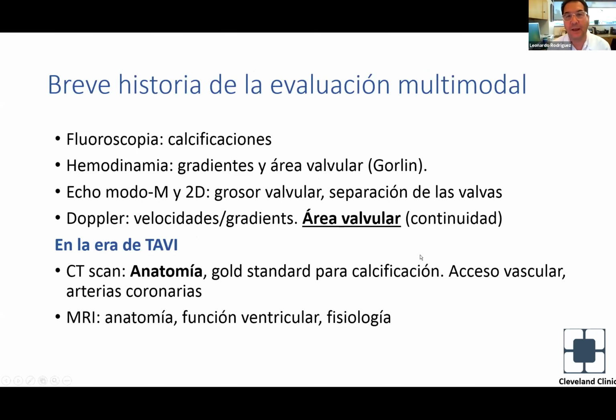Como decía el doctor Piñero, yo soy un poco mayor ya y me ha tocado vivir realmente la historia de todos estos procedimientos. La historia de la evaluación de la válvula aórtica con múltiples modalidades obviamente tiene mucho tiempo. Sabemos hace muchos años que la válvula calcificada va a tener mayor severidad de la estenosis aórtica, y esto se vio fundamentalmente con fluoroscopia, que era una forma diagnóstica de esta patología.